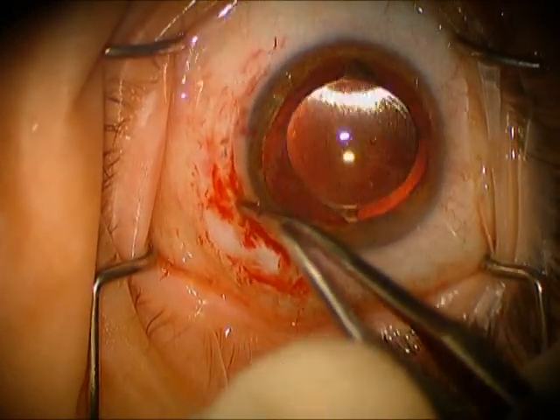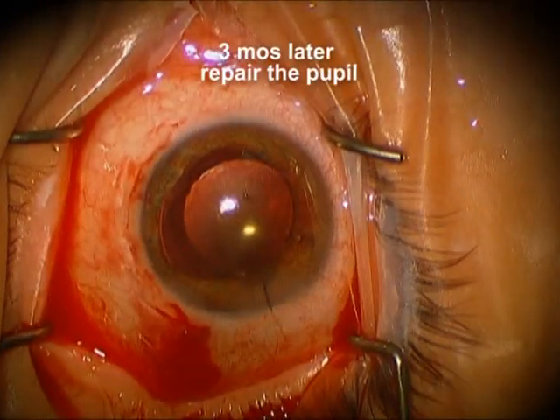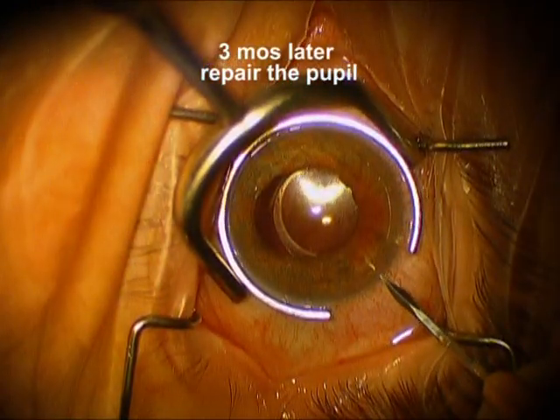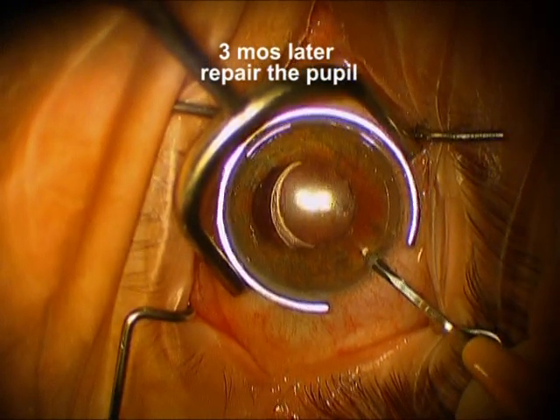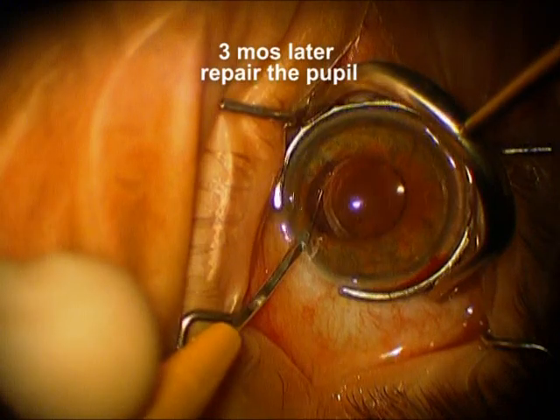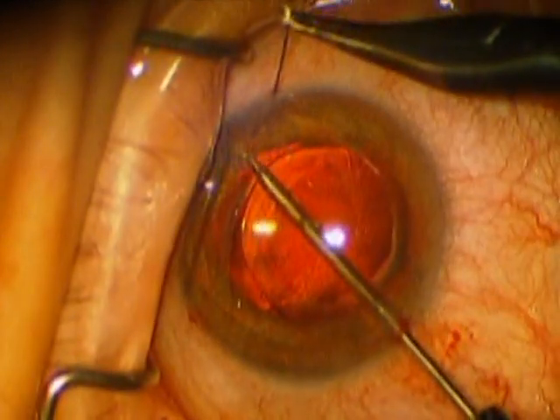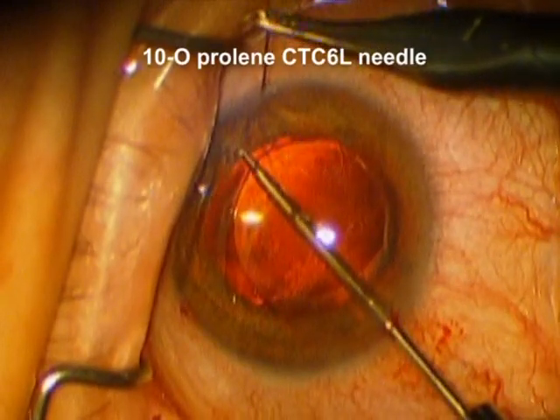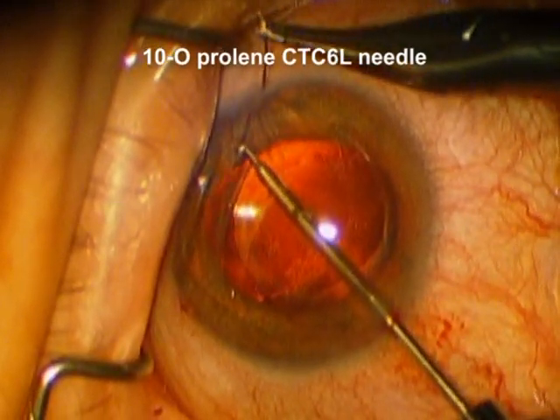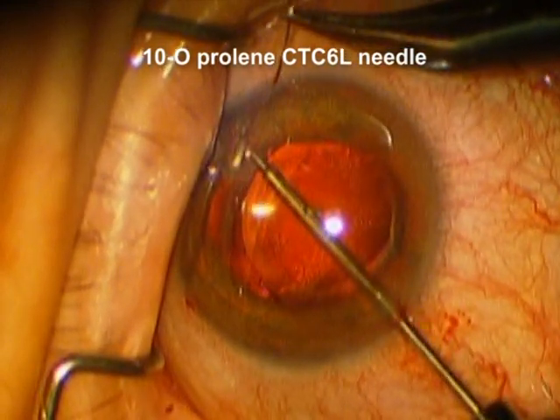And then we're going to re-approximate that conjunctiva and suture the incision. Now we're three months later and the patient had complained of an irregular pupil and had complained of significant glare. So we're going to go ahead and suture in the area of the injured iris sphincter. We're just going to place one suture with 10-O prolene.